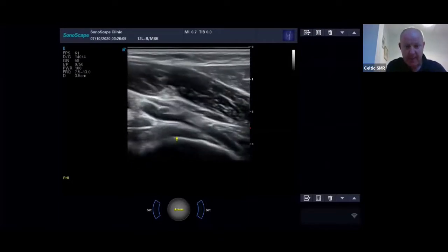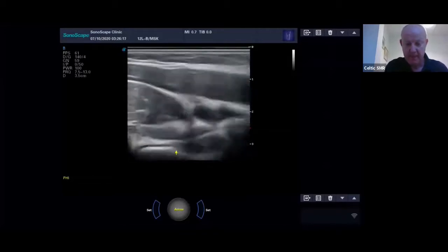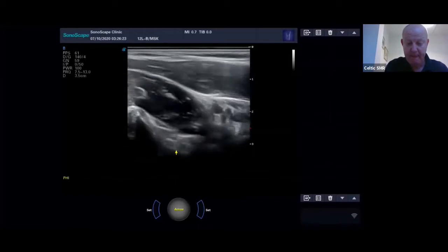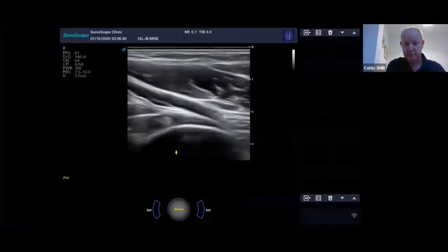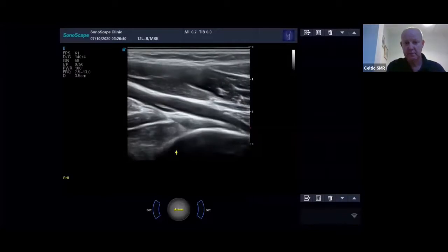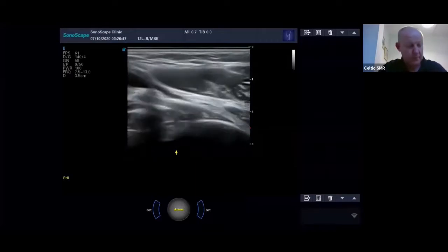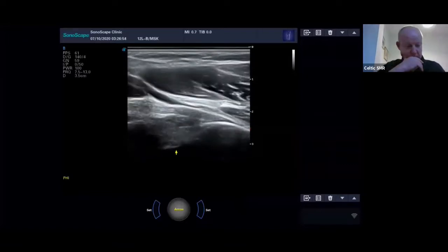Let's just get this now. There you go, guys. It's always a learning experience every time you scan. Easy. That's it. There. So it is just lateral to the vessel here. So if I just angle that down, and then I'll freeze this in a second, and you can hopefully see it there again.